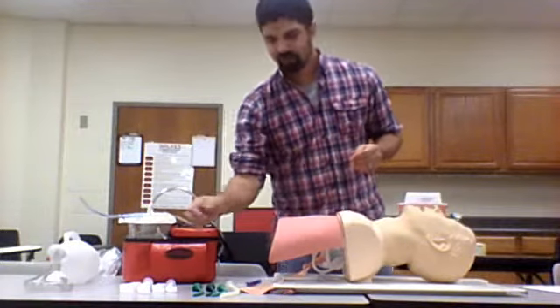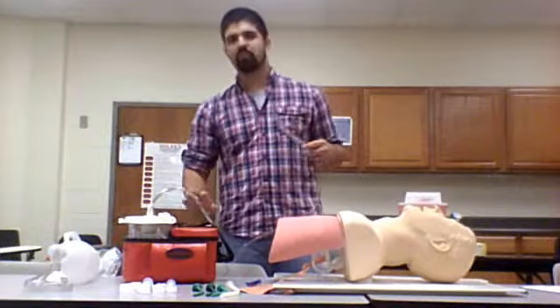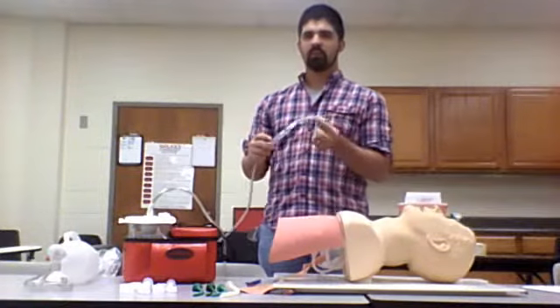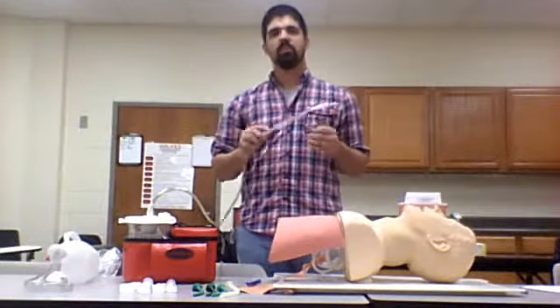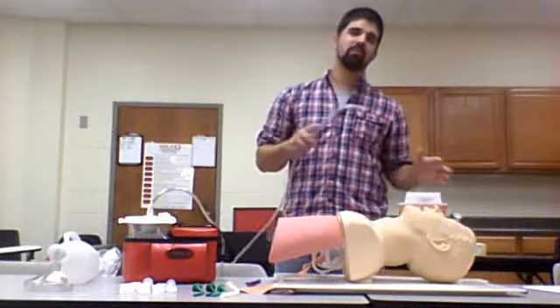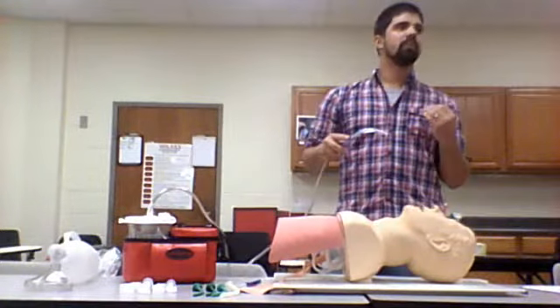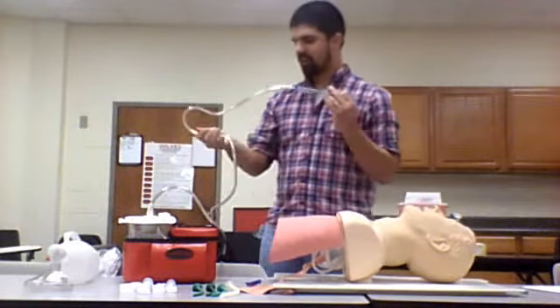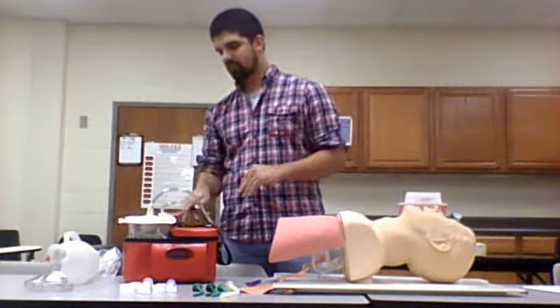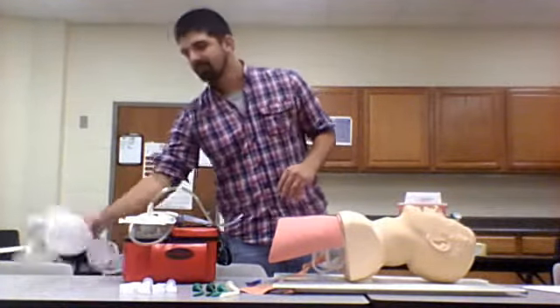Now, another tool we'll look at today is a portable suction device. We have a Yankauer, a hard tip suction catheter with some suction tubing. We're going to use this just in case. Anytime you're managing an airway, if there is fluid or vomitous material or secretions in the airway, you can take care of that using this device, and we'll touch a little bit on that later. We're just going through right now, introducing the equipment.